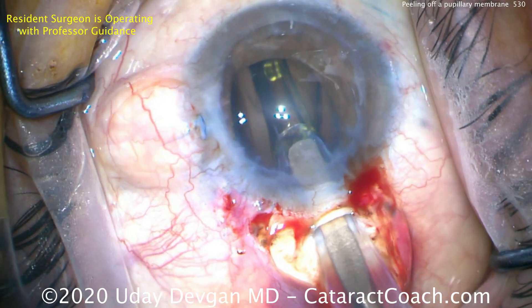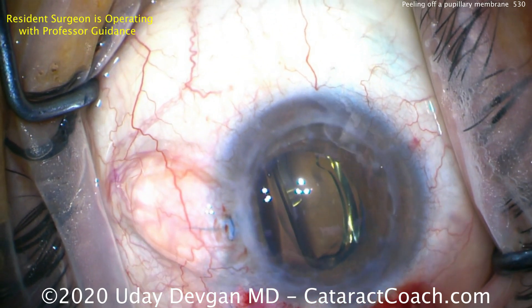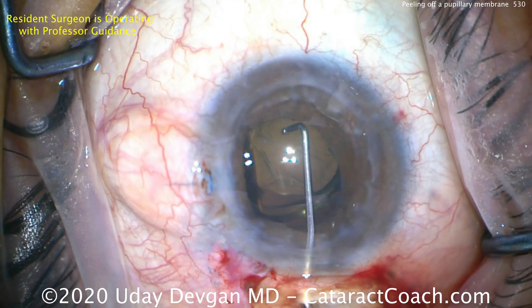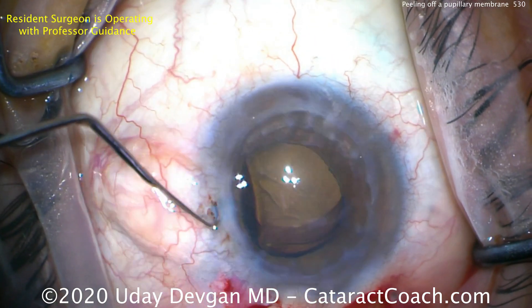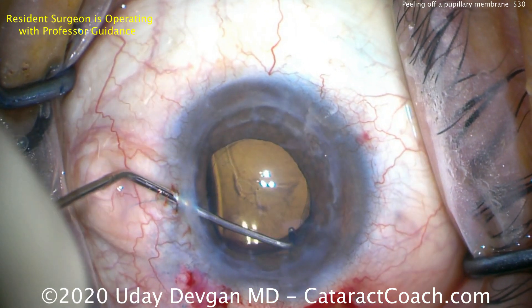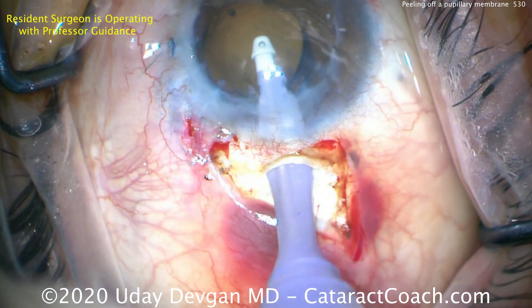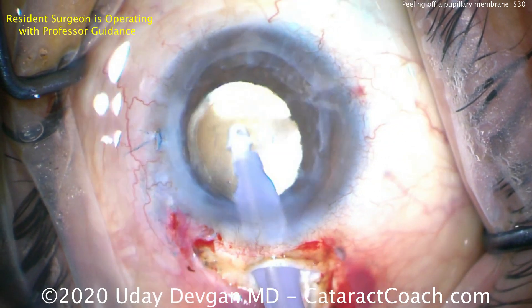With this cornea, we chose a higher lens power to make sure the patient ends up myopic. The patient can certainly wear a contact lens or a rigid gas-permeable lens to help optimize vision, or if the cornea is fairly regular we can do laser vision correction — an excimer laser ablation. It's important to end up myopic, not hyperopic, so always look at the central corneal zone on topography and choose the lowest K power in the central three millimeters for your calculations.